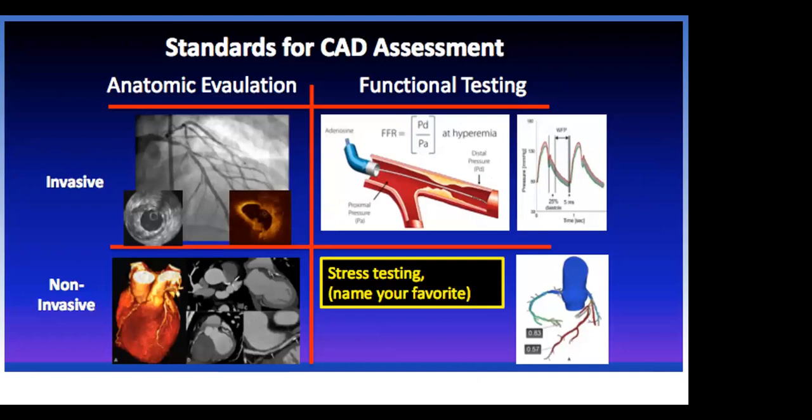So if the angiogram is so bad, as I just demonstrated, and has so many flaws, do we have anything better to do? On the bottom, there is CT angio, which is a 3D reconstruction of the CT scan and has its own flaws. We were hoping it would decrease the amount of diagnostic coronary angiograms we have to do. Unfortunately, the opposite is the case, and we're doing more and more because of the CT scan. Then we have a stress test, which has its own flaws, but everybody should have a stress test before they even come to the cath lab.